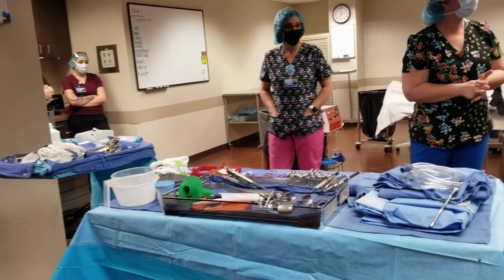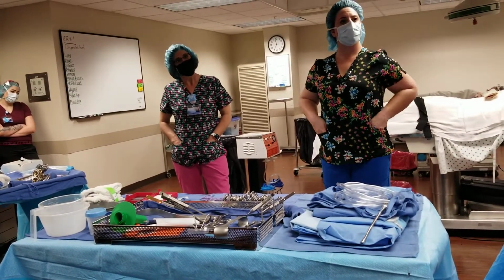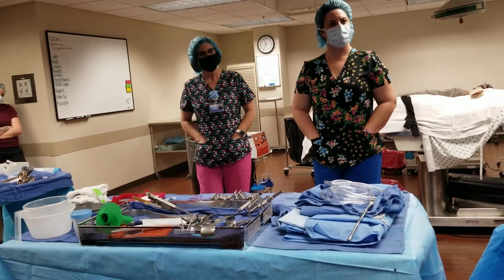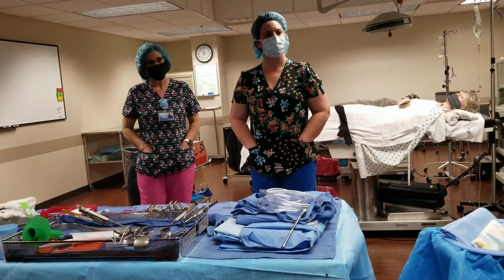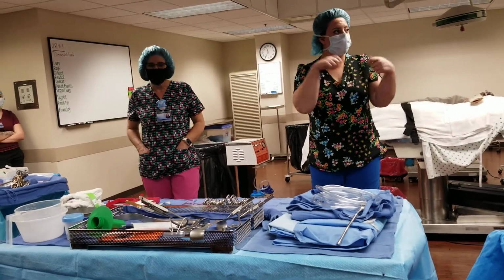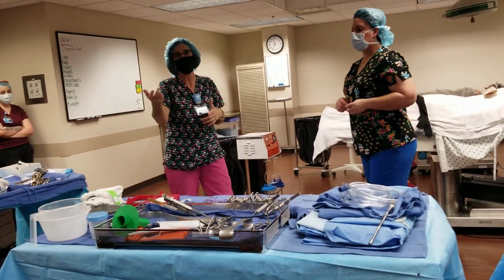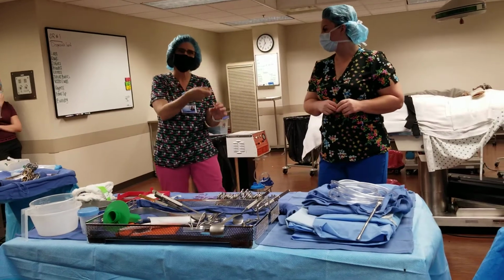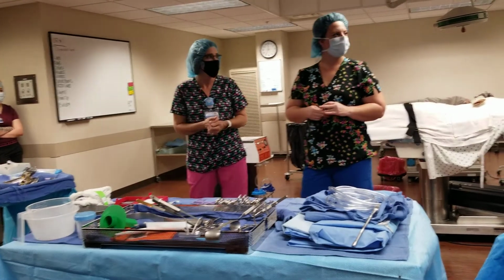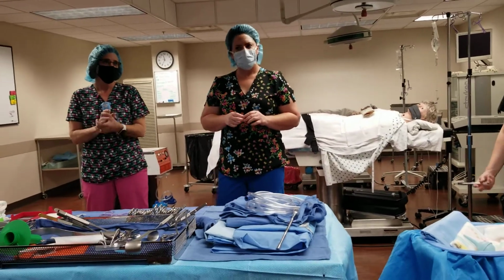What else did I miss, or what are you guys thinking of? Questions? I had a question. Mrs. B highlighted the empty syringe for cord blood. The book says to have like 2 specimen cups handy to collect it. So with the syringe, what are we doing with that instead? My experience has just been you pass it, they draw it up, and you just pass it off. Typically the syringe just gets capped, and they send the whole syringe. You don't typically transfer the blood from one to another. Typically if you're drawing blood for any reason, you send it in that syringe. I've had them put it in the med cup and then I've drawn it up and handed off. However it goes, we still ask our same questions for labeling and handing off.